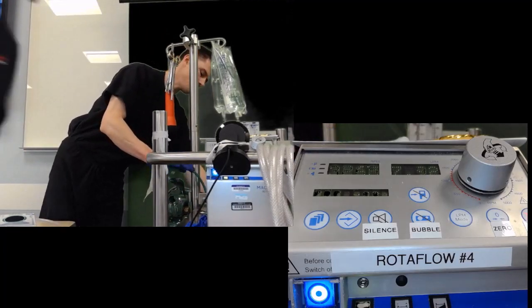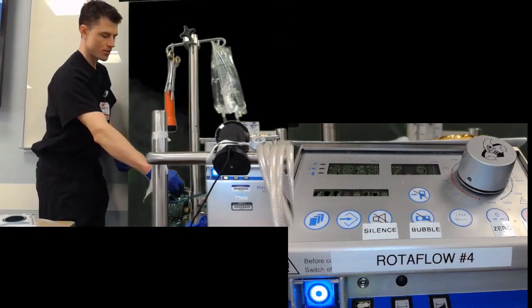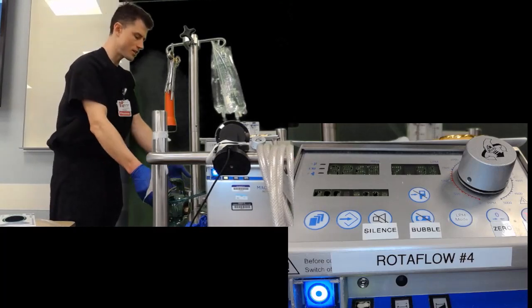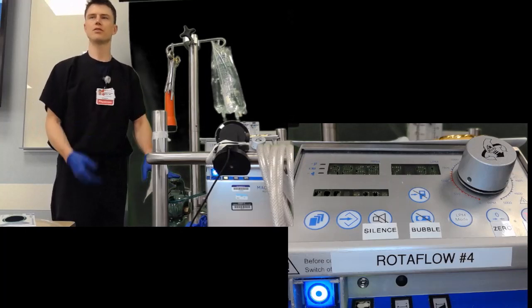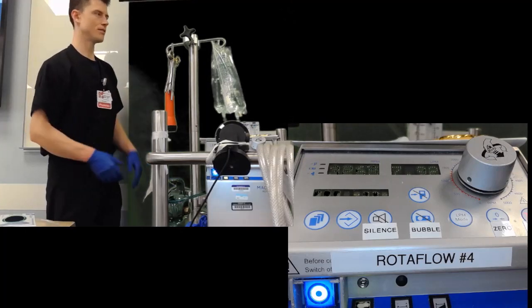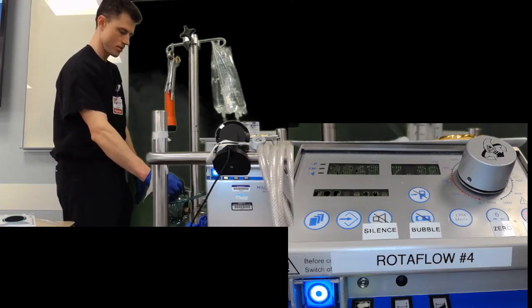Okay, not an oxygenator. Or let's say you turn it up to 4 liters and you're all hooked up and you're still not oxygenating. Make sure your tank is actually full. If your tank ran out, it's not going to alarm. It's not going to tell you that. You're just going to see the patient desaturate. All right, very good.